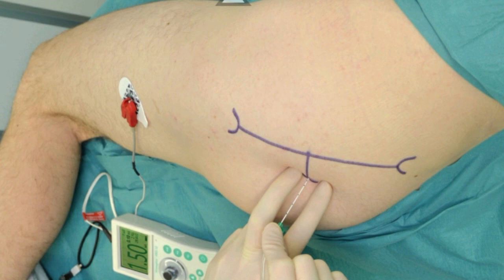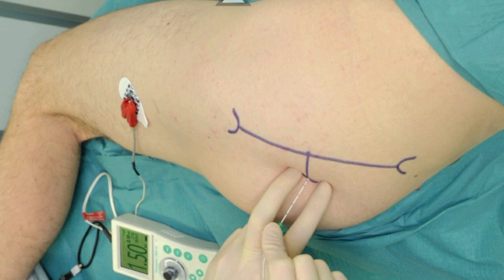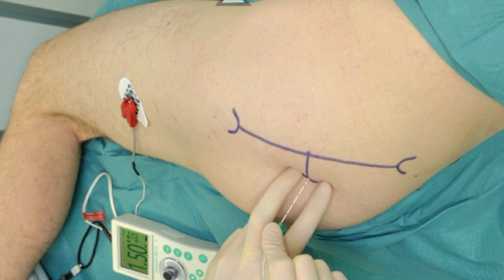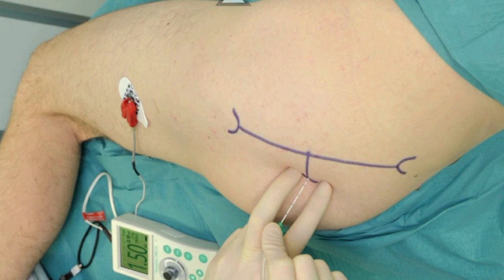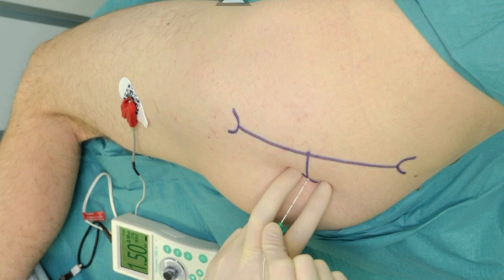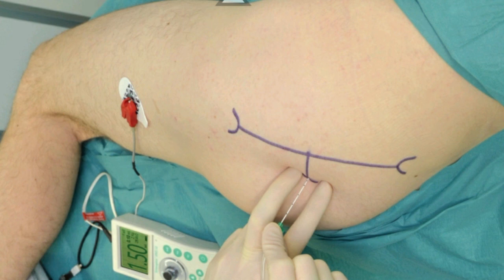After the initial stimulation of the sciatic nerve is obtained, the stimulating current is gradually decreased until twitches are still seen or felt at 0.3 to 0.5 mA. This typically occurs at a depth of 5 to 8 cm. After negative aspiration for blood, 15 to 25 ml of local anesthetic is injected. Any resistance to injection should prompt needle withdrawal by 1 mm and re-attempted injection. Persistent resistance should prompt complete needle withdrawal to ensure needle patency before reintroduction.